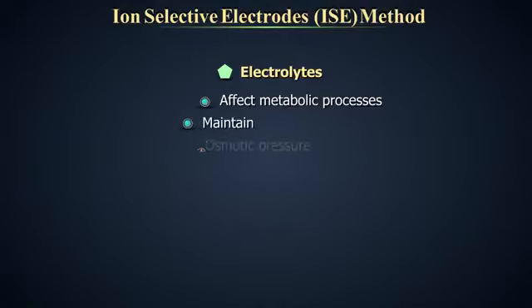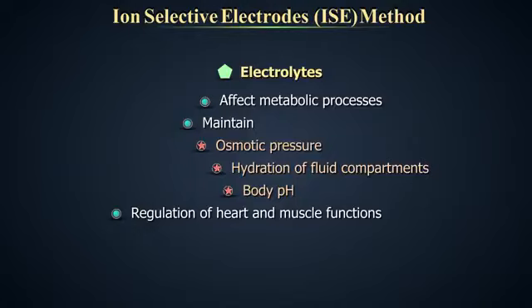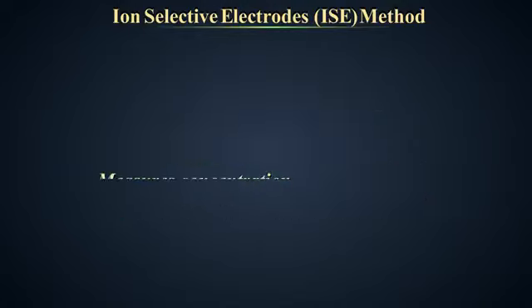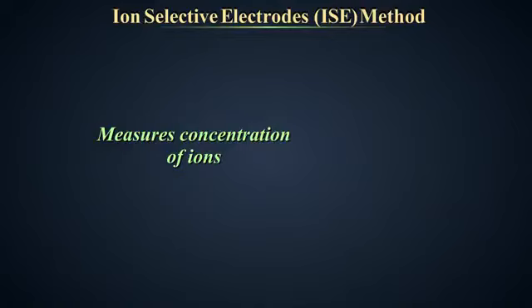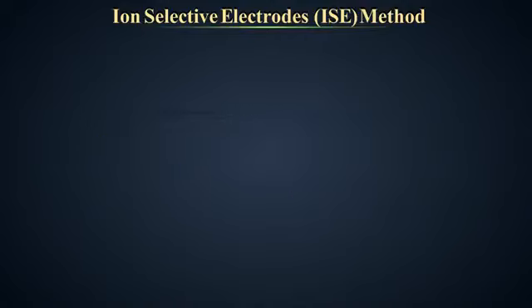They serve to maintain osmotic pressure and hydration of various body fluid compartments, proper body pH, and regulation of appropriate heart and muscle functions. Ion selective electrodes are used in clinical chemistry to measure concentration of ions like sodium, potassium, chloride, and calcium in blood, serum, plasma, cerebrospinal fluid, and urine.